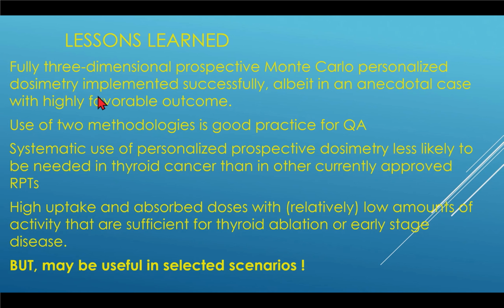And the patient did incredibly well. Of course, it's an anecdotal case. The tumor resorbed, the patient went home, and 20 years later she's doing, well, no, I guess not 20 years later, it's 17 years later, she's doing fine. So we can do this, and it's probably better. She definitely got more activity, so she certainly got more dose to the lesions, and yet it was safe. Okay.